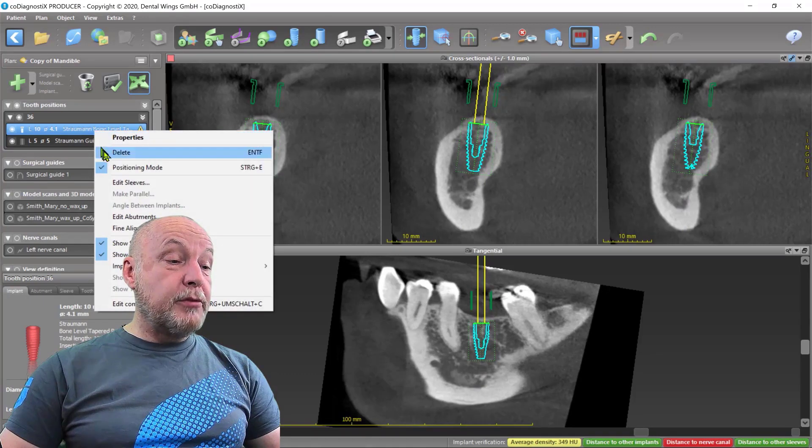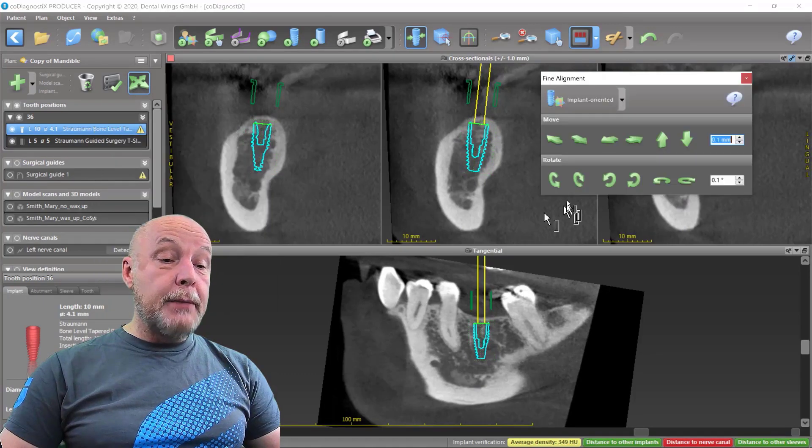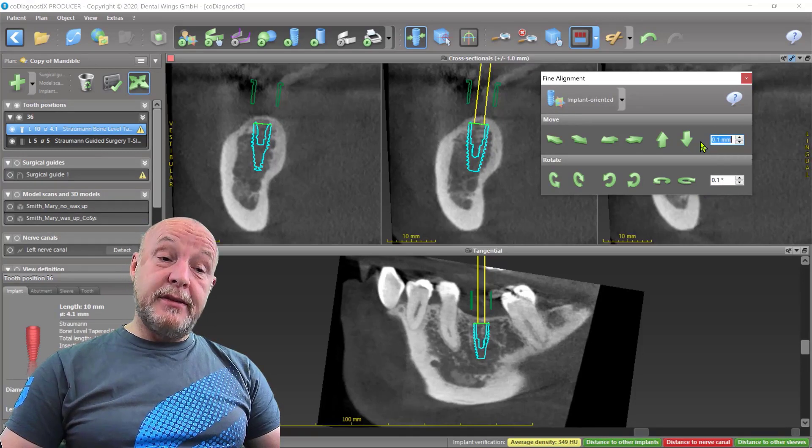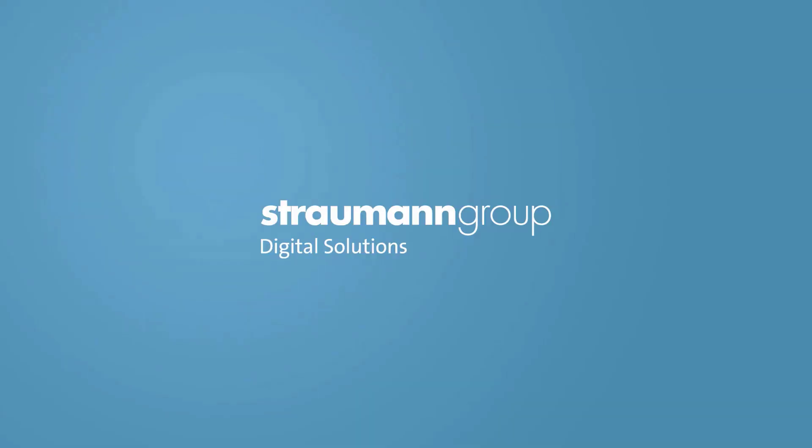If you go over the implant directly or on the left side, press the right mouse button, go on fine alignment, and then you can make short steps up, down and rotate it. I have it at 0.1 degree and 0.1 mm to make only small movements. This is everything possible just for implant movement, so you'll surely find a role and benefit.